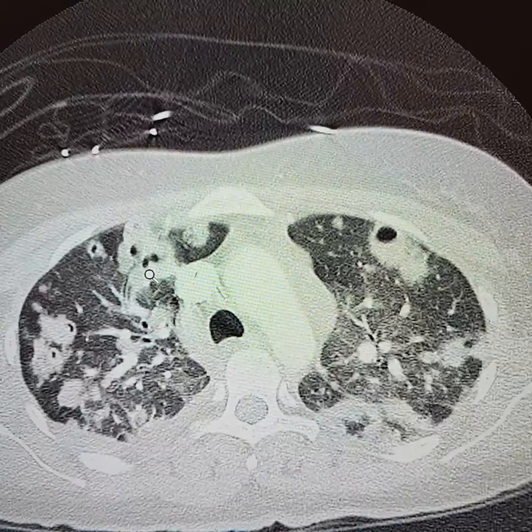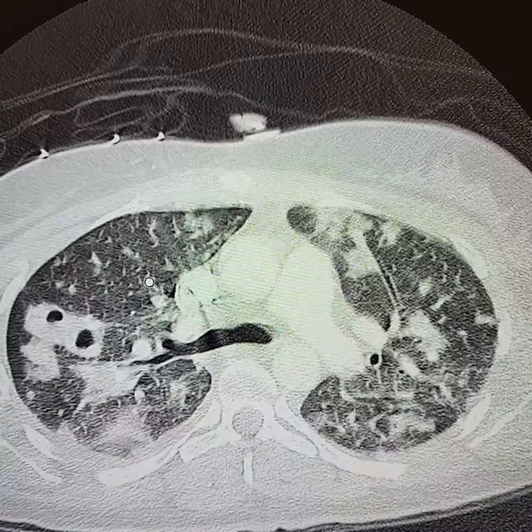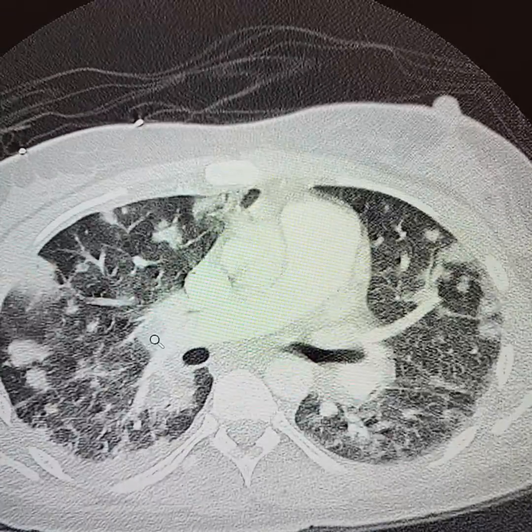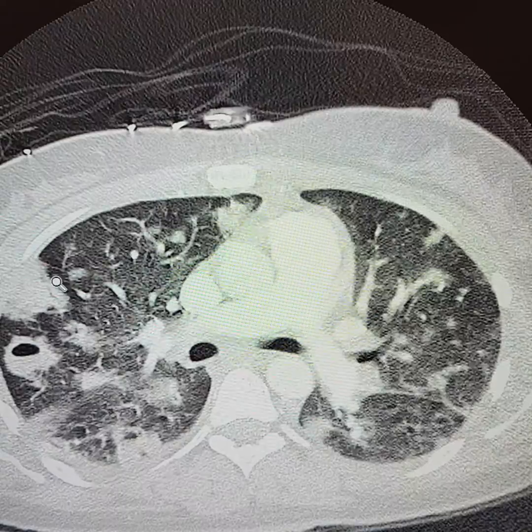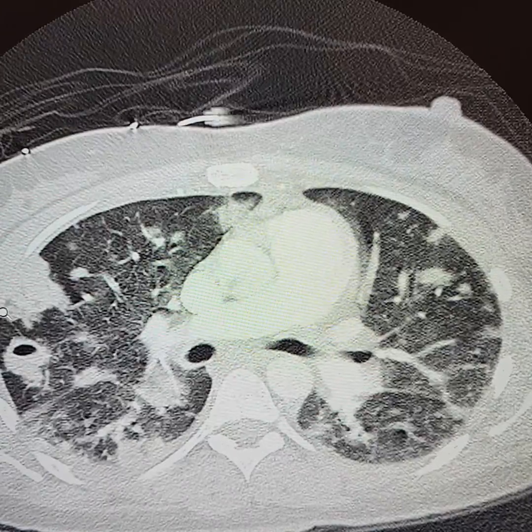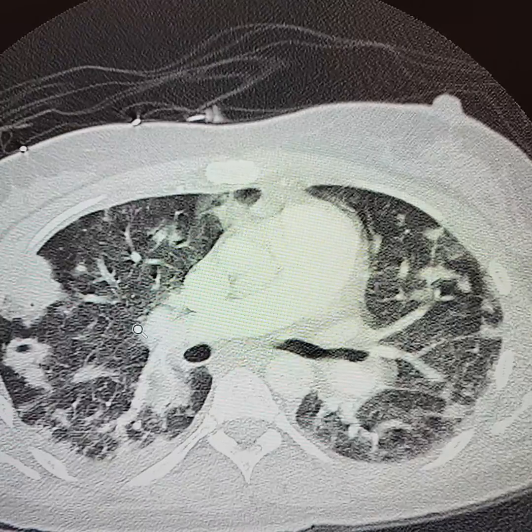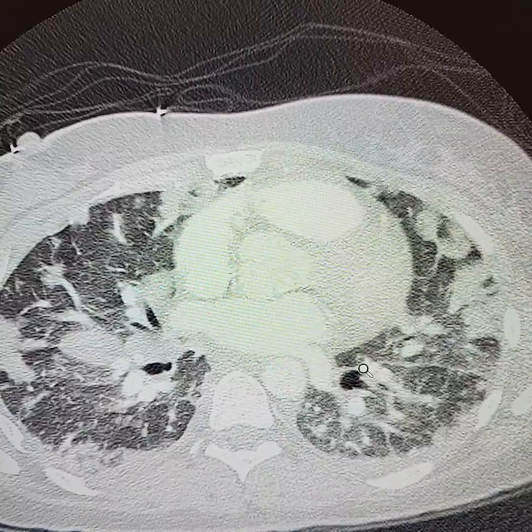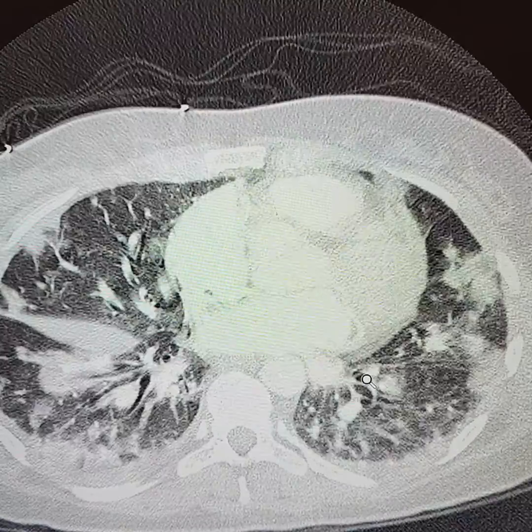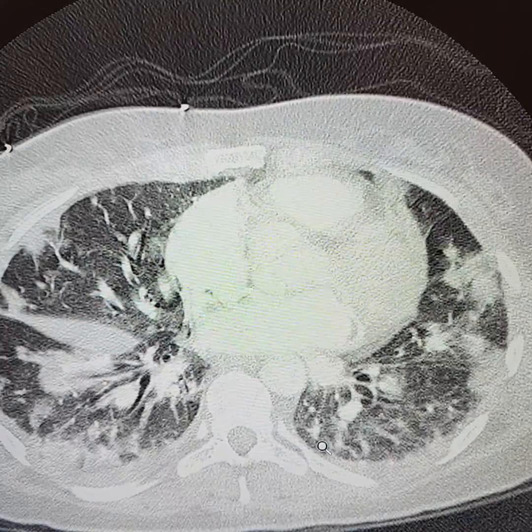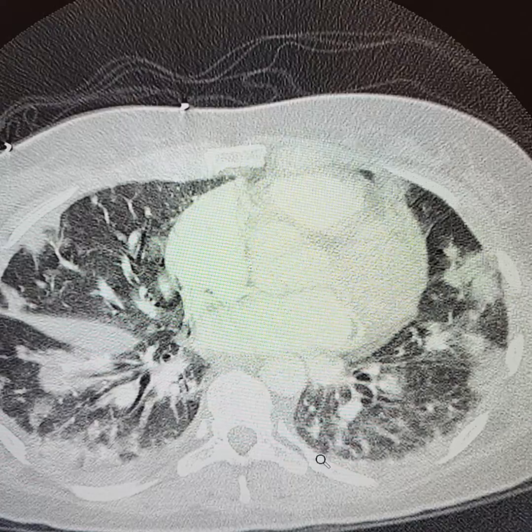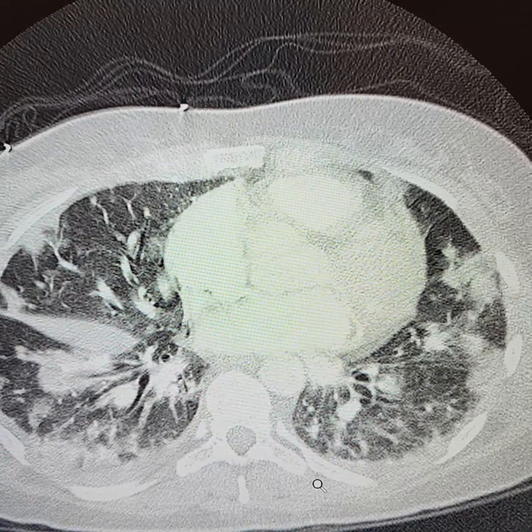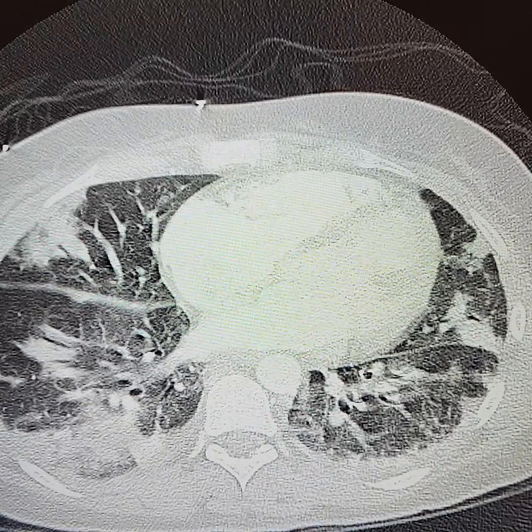Largest one here. There's a peripheral predominance, and if you look in the lower lobes, some of them have a wedge shape. This is in a 29-year-old lady who uses intravenous drugs and came in with septic shock.